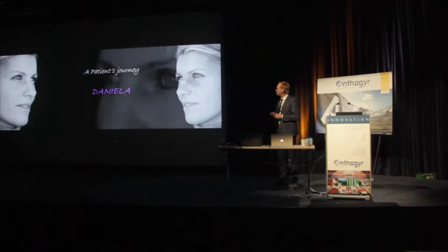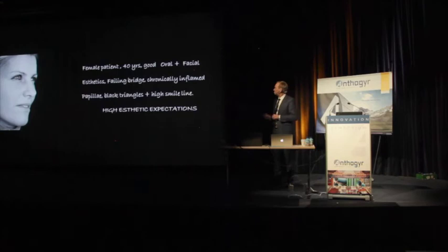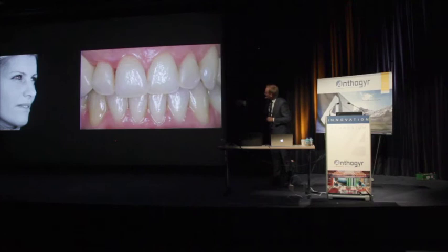She was a dental assistant, not in my office, but in the past. And in the year 2008, she came to our clinic and she wanted to get a treatment for a failing bridge. And she had some periodontal problems, papillae, black triangles. There was some chronic inflammation in this area, for instance. And the bridge, 2 missing premolars, started from the canine on this side.